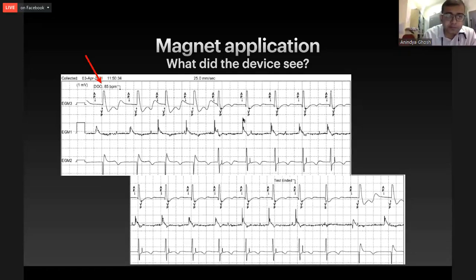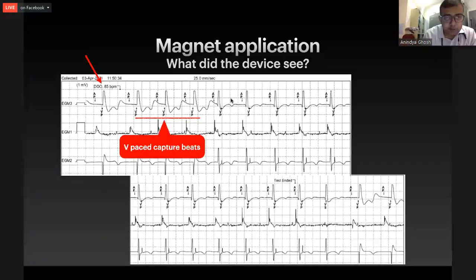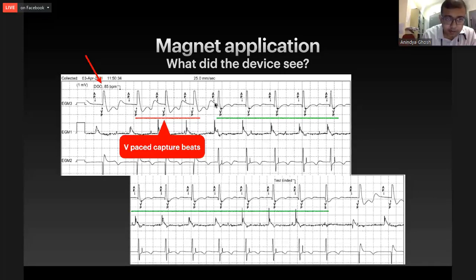So in short, the first 3 beats are ventricular captured. However, starting from the 4th beat, there is a QRS which is not the result of a V pacing spike. So there can be a possibility that this QRS is the result of a conducted atrial event with a short PR, which is highly unlikely because we saw the intrinsic rhythm just now. Or an even unlikelier possibility is that the A-paced event led to an atrial depolarization that actually conducted down to the next QRS, due to an abnormally long AV delay.